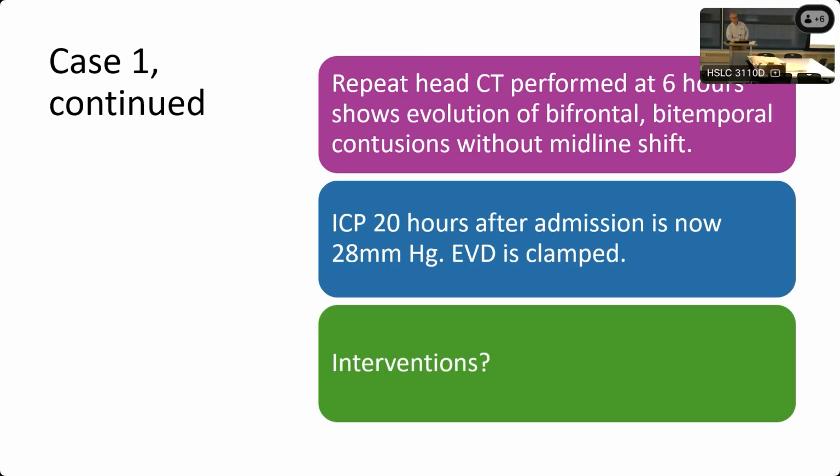And so, yeah, you can check all those pieces, want to make sure that those are appropriate. So if zero is below there, is the pressure going to be falsely high or falsely low? It's easier to go over the hill, right? And then the other way around. So if they lower the head of the bed, and they didn't change the level of the transducer.